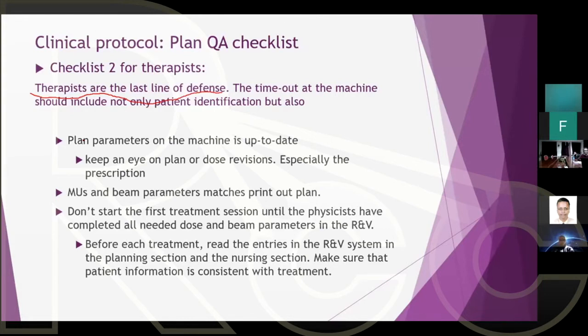We do have in our own institution, myself and Dr. Sara, we work for the same institution. We have monthly meetings where we look at the errors and we send them to our chief of physics, we send them to the chairman, and we always discuss them. And we have a recent checklist that was implemented in September because we caught particular errors, particular mistakes were happening all the time.